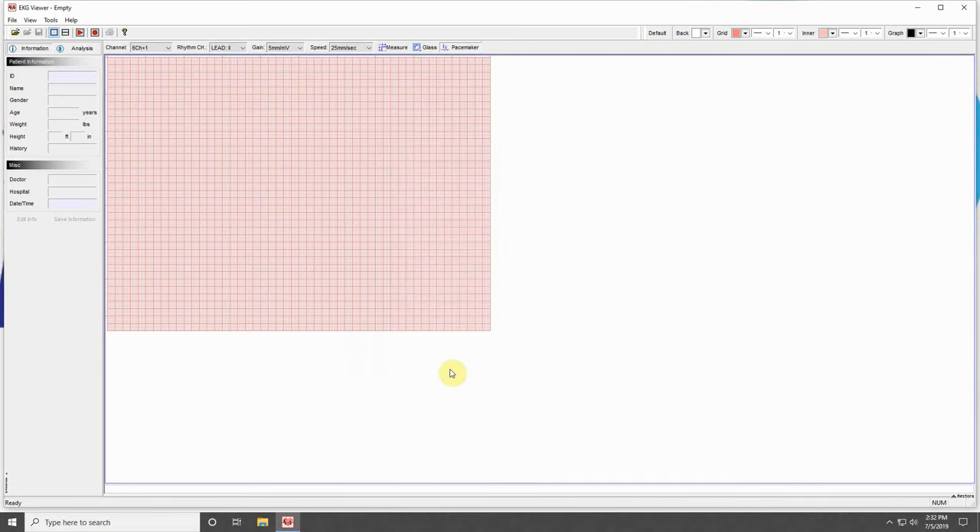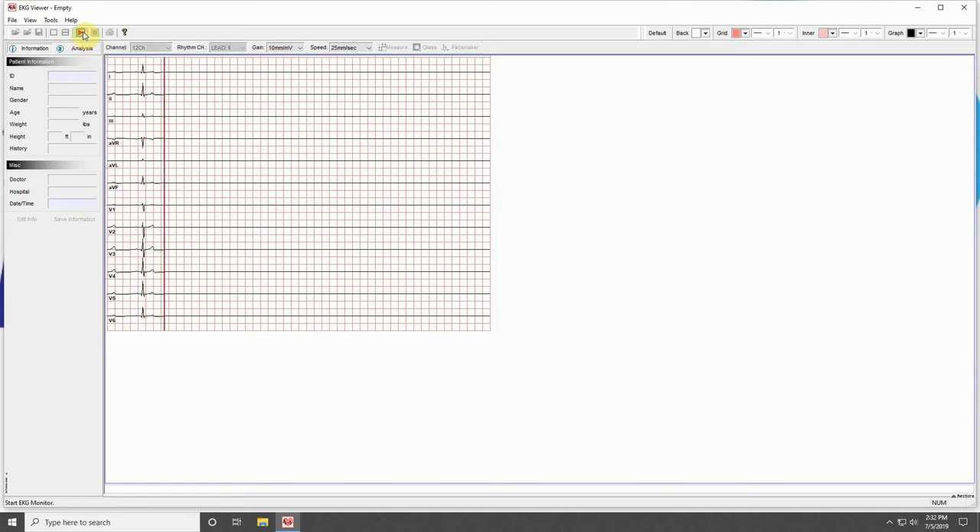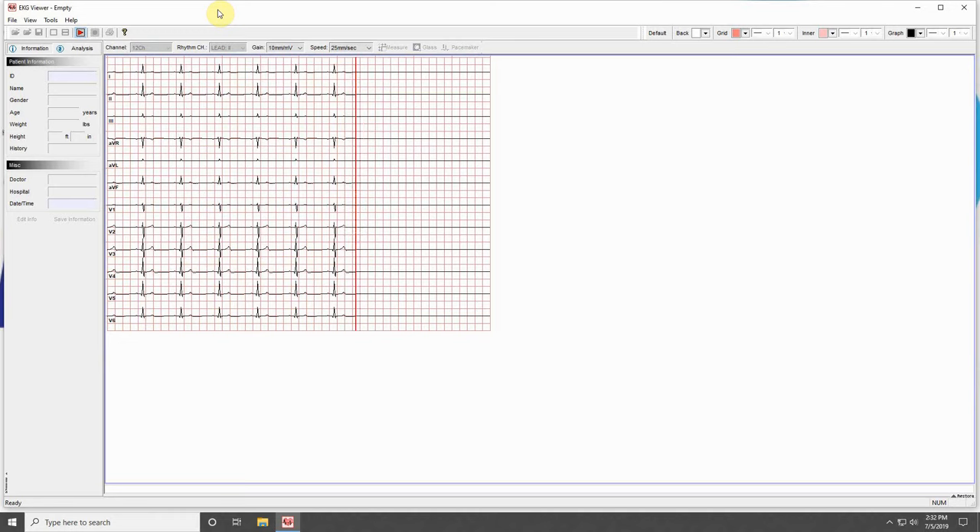Press OK at the bottom of the window to exit settings. Press the red Play button on your EKG Viewer program, and a red bar should begin scrolling to the right. This indicates that your computer is connected to your machine. Congratulations on your Cardio 7 wired connection!